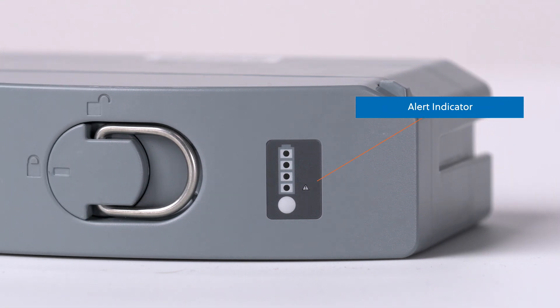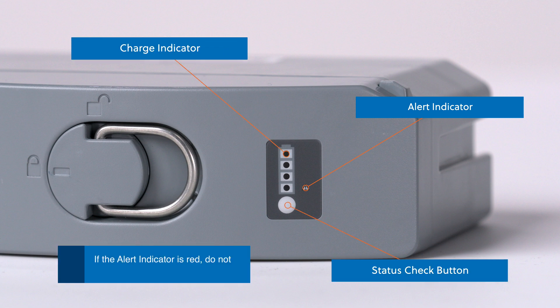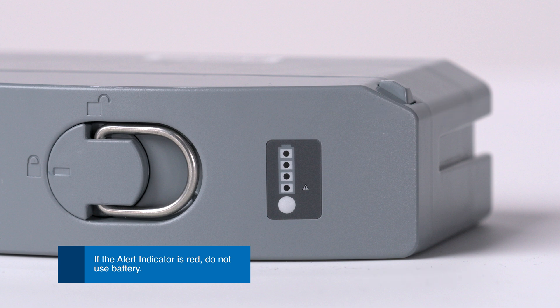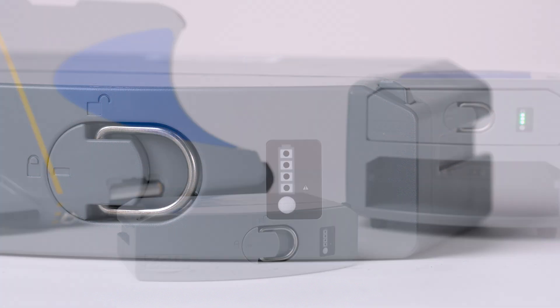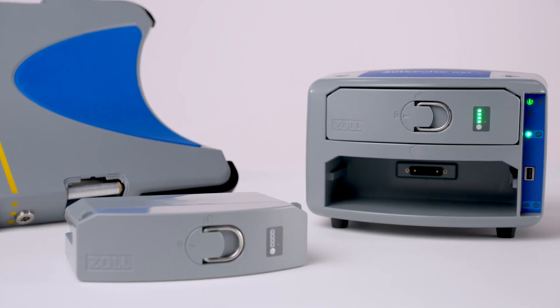The alert indicator is located under the charge status indicator on the battery. If it is red, the battery has failed and cannot be used. The battery should be disposed of and replaced. Proper use and maintenance of the batteries and the charging platform will optimize battery life.